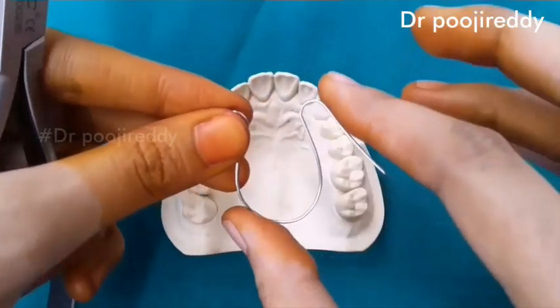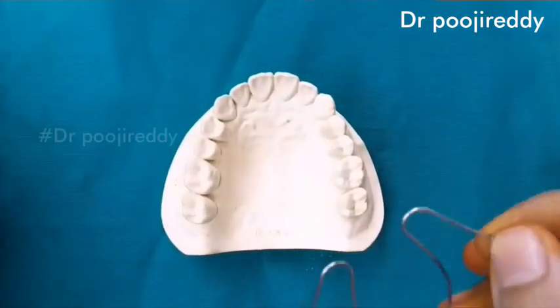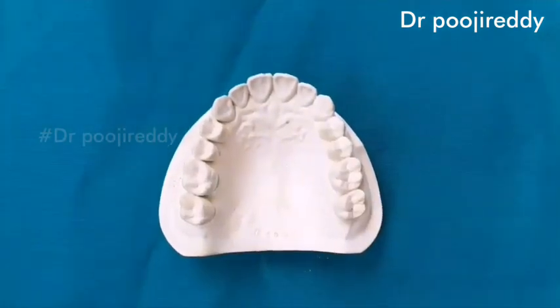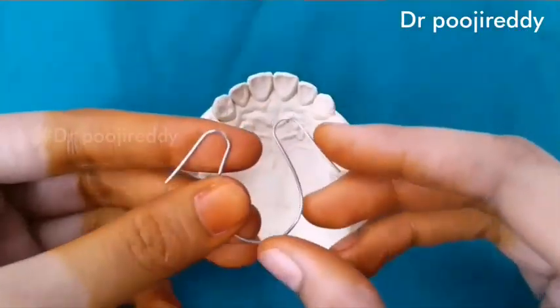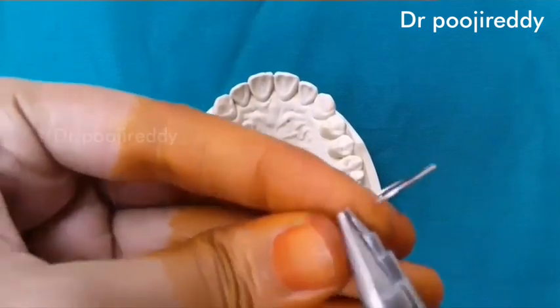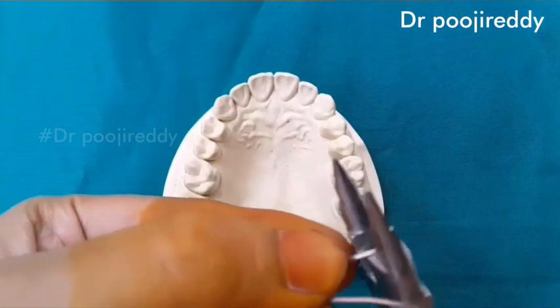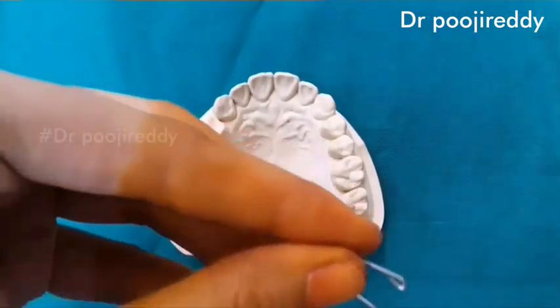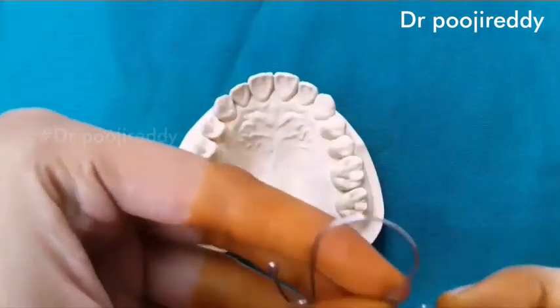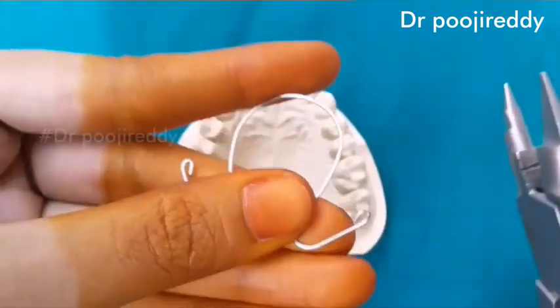Cut the extra wire on both sides. Close the ends of the coffin spring — that is both arms — so that it doesn't hurt the hard tissue.